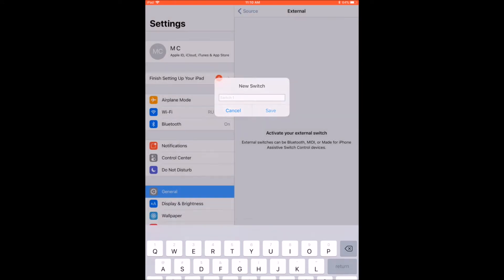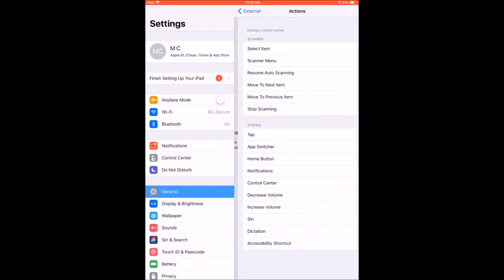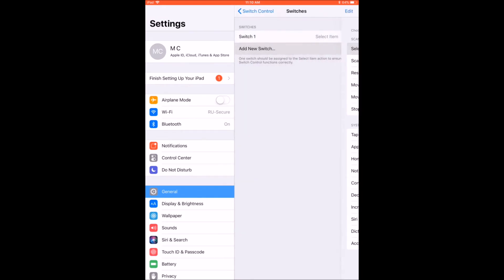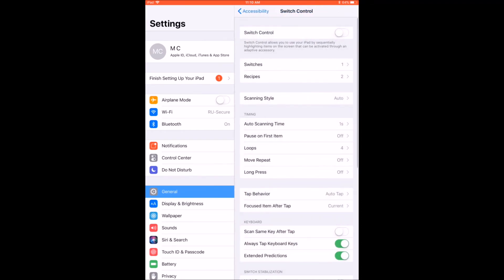In the Actions window, assign the switch an action from the list. If you are using a single switch, choose the Select Item action, then go back to the Main Switch Control menu, and make sure that the Scanning Style item is set to Auto.